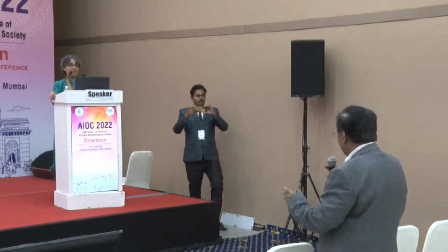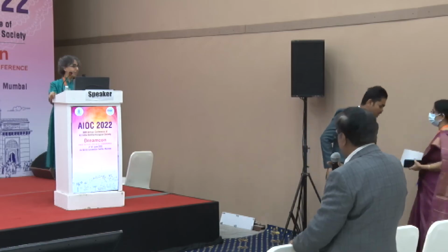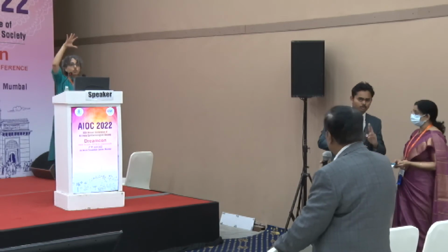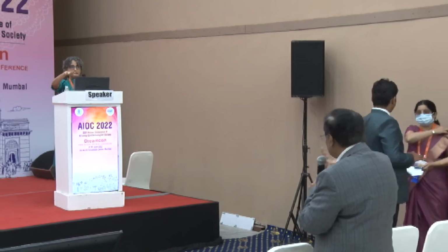That was real because you were discussing all that RNFL and this ganglion cell, etc. So if the signal strength is 4, you have to pay extra attention. Some of it could be erroneous, but the pattern will not change. See, a signal strength will give you generalized RNFL, but these are images, which is ultimately interpretation.